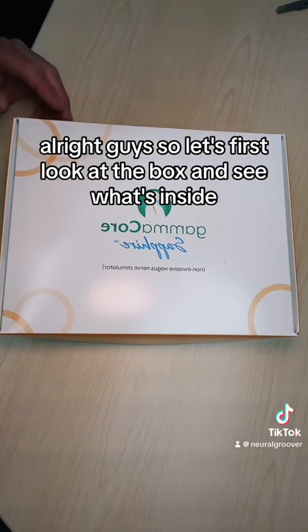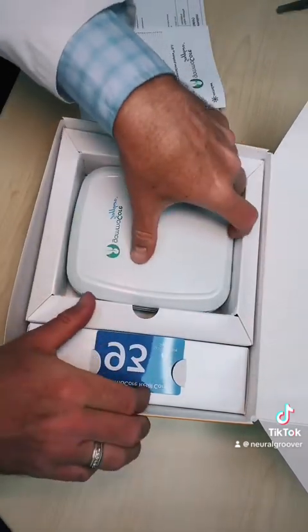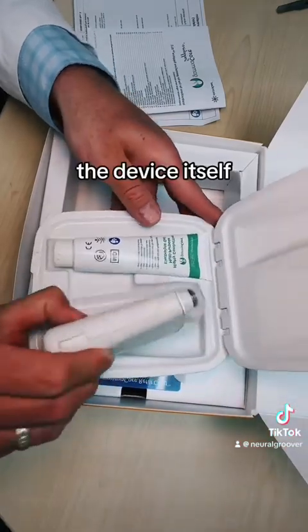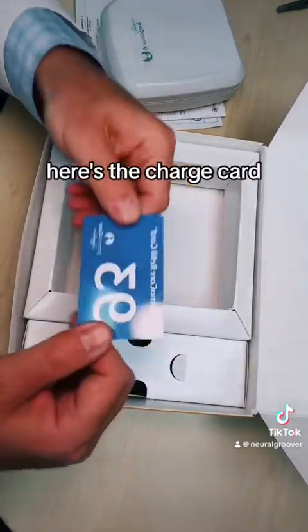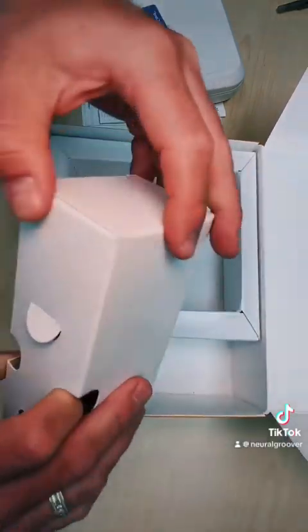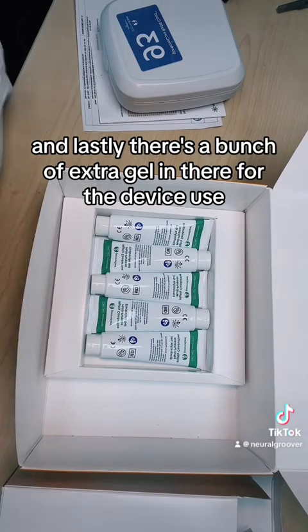Let's first look at the box and see what's inside. There's some safety information, instructions, and here's the GammaCore device itself, along with gel to use the device — we'll show how to do that in a moment. Here's the charge card; you charge it up with three months of treatments. This is the device charging cord, and lastly there's a bunch of extra gel in there for device use.